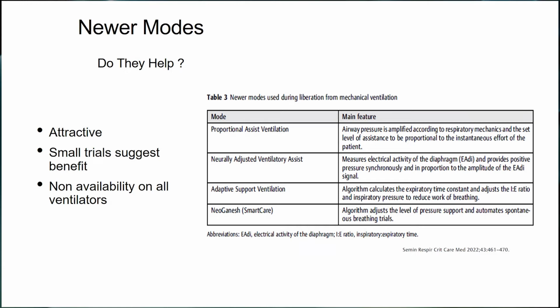Do newer modes help? Well, a lot of new ventilators are coming up with modes which can adapt to the changing ventilatory needs and give support based upon the patient's changes in the respiratory compliance or the resistance. Now, there are small trials which have shown benefit, but the major problem is these modes are not available in all ventilators. I don't have any of these modes. I don't use them regularly. But if you have the facility, you can always try the newer modes, which seem to be very attractive, but whether they really help in getting patients off the ventilator is still something that we need to see.